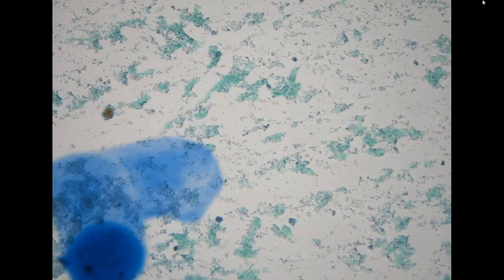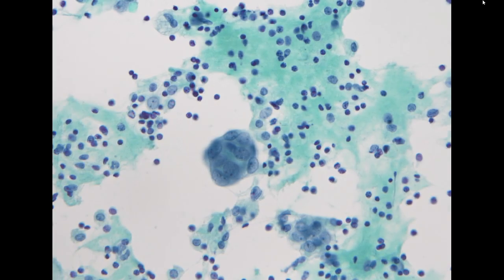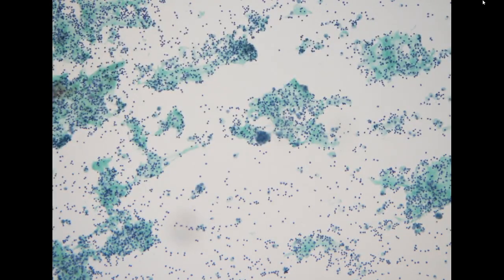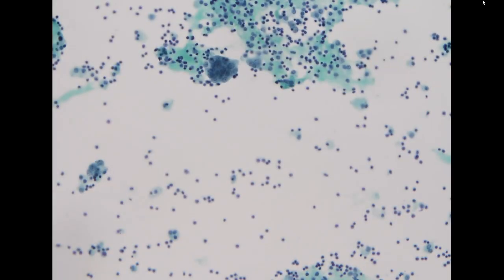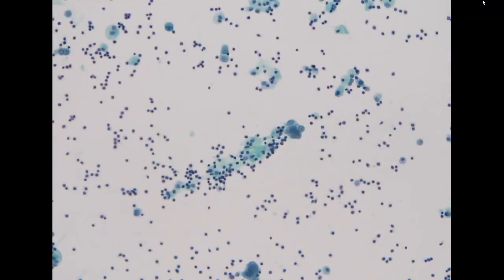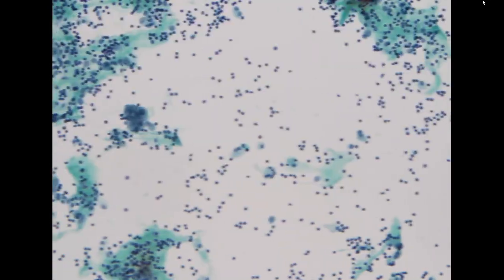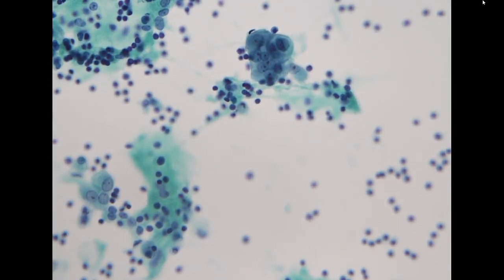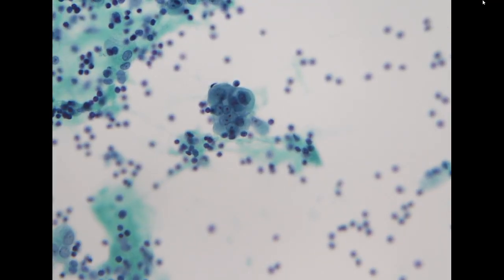The patient's clinical findings suggest that she might have peritoneal carcinomatosis, probably arising from a GYN organ. It is common, if the abdominal cavity is already involved by adenocarcinoma of a GYN organ, to see concurrent involvement of the pleural cavity. So this is probably not primary lung. This is probably from a GYN organ. It could be primary peritoneal or a tubal or ovarian adenocarcinoma, most likely a high-grade serous carcinoma.